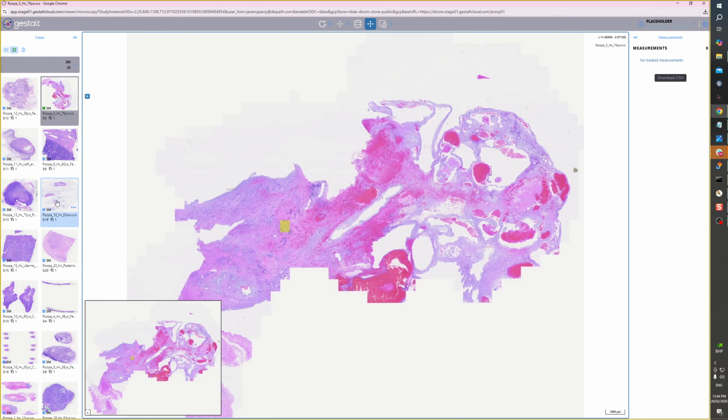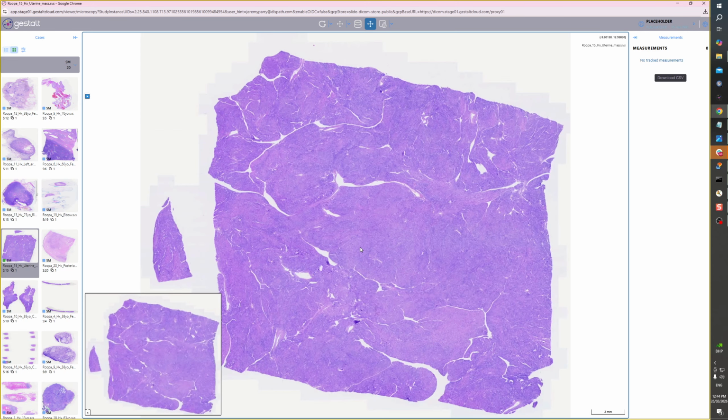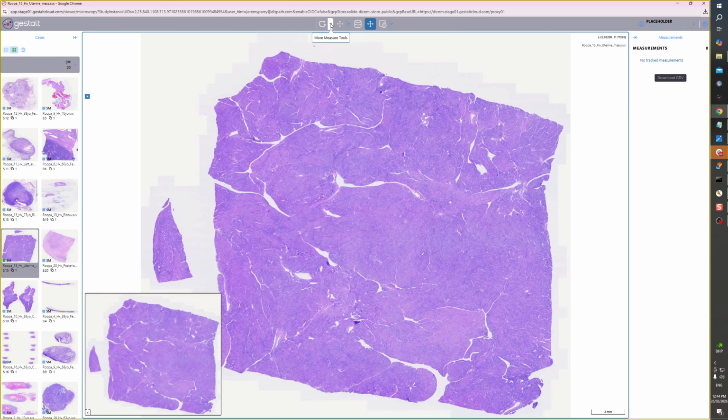So as you probably worked out, to open an image in the slide tray, you can either double click it or just click and drag. It'll open, and then you can annotate it. The annotation functions are at the top. There is a drop-down menu for the different tools, and a drop-down menu for modifying the annotations once you've applied them using the tools.